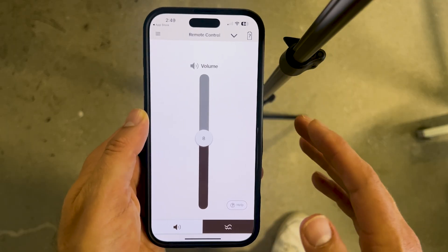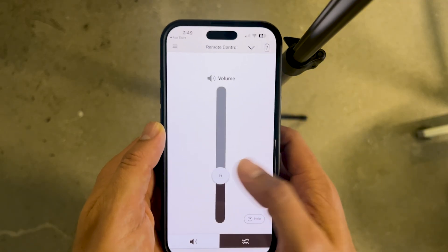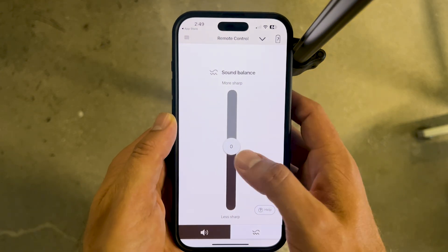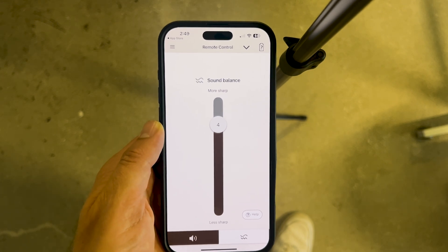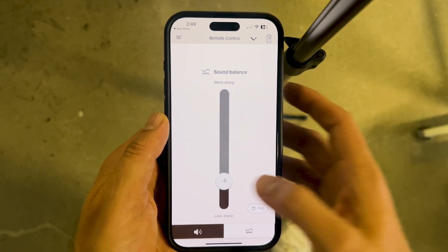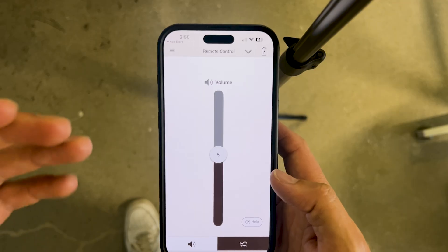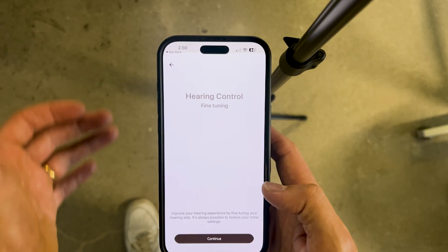Within the main screen of the Sony app, you'll see a couple of basic controls. The first is simply a volume slider — you can slide the volume up or down, and as I do that, I'm hearing my hearing aids change significantly in the volume of the sound around me. You can also go into the balance section and change the balance to provide more sharpness — crispness in S's, T's, and consonant sounds — or go with a rounder, bassier sound. Both volume and balance are basic functionalities; for significant changes, you'll want to head into the fine-tuning section.